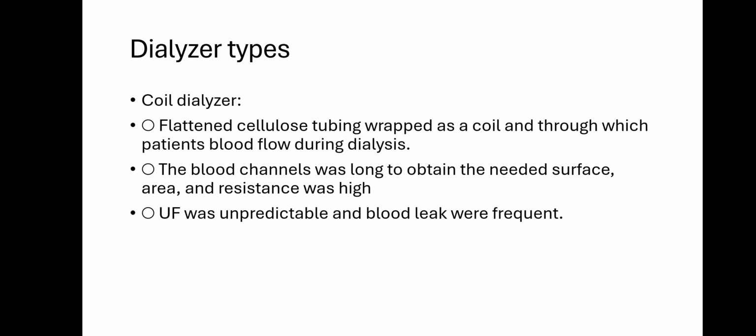Next, the dialyzer types. There are three dialyzer types. First is the coil dialyzer, then the parallel plate dialyzer, and most commonly we use the hollow fiber dialyzer. First we discuss what a coil dialyzer is.